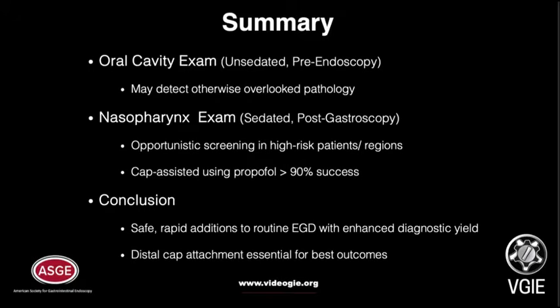In summary, unsedated pre-endoscopy oral cavity examination may detect otherwise overlooked pathology. A sedated post-gastroscopy nasopharynx exam provides opportunistic screening in high-risk patients and regions and can be performed cap-assisted using propofol with more than 90% success.